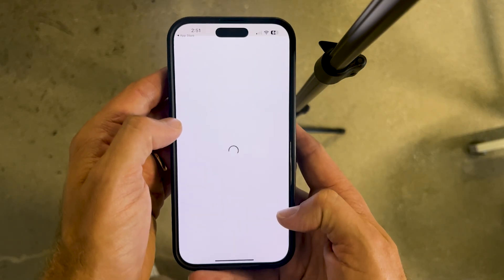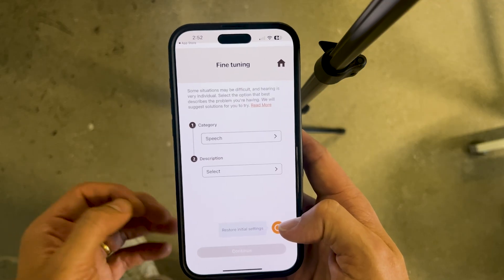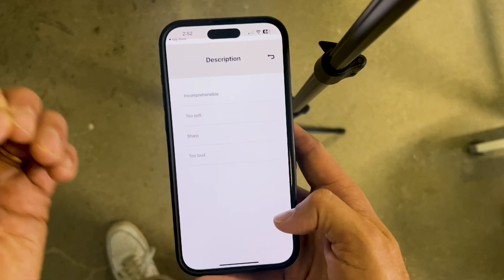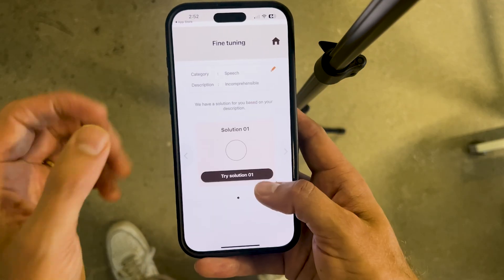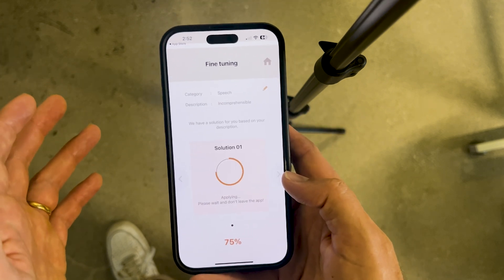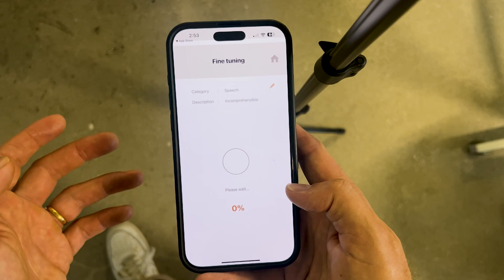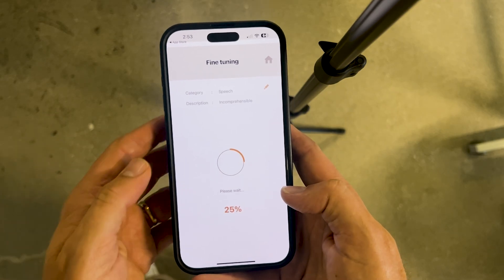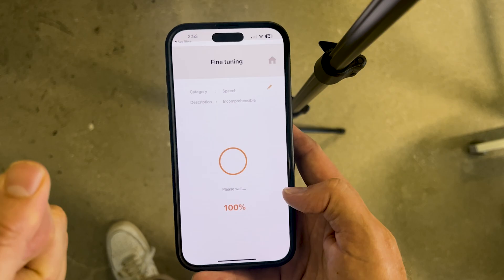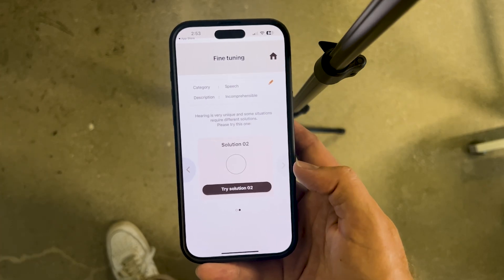Let's say you're having difficulty with speech — maybe you're in background noise and not getting the clarity you want. You'd head into the speech section and tell the app what you're experiencing. If you're in a noisy environment and can't get speech picked out of the background noise, you might say "incomprehensible." This creates a program that separates speech and noise. If you try the solution and don't like it, you can say no — it removes that program and gives you another option targeted at the same problem. There are multiple different solutions that the engineers have put in place, so you can keep trying until you find what works.